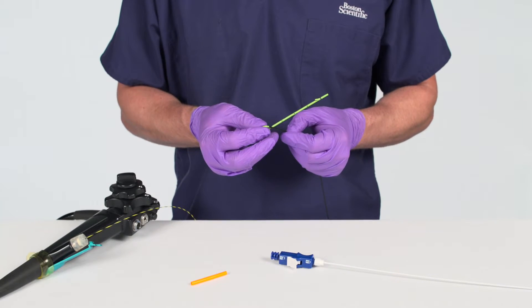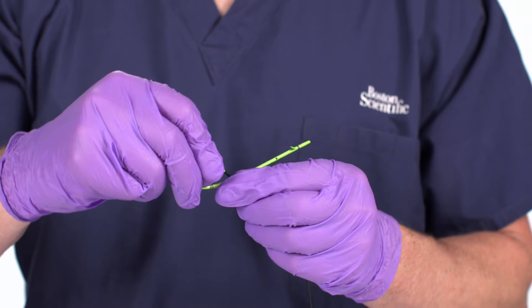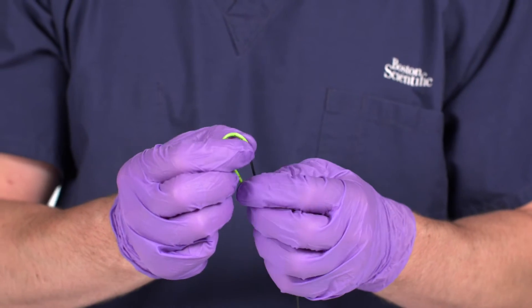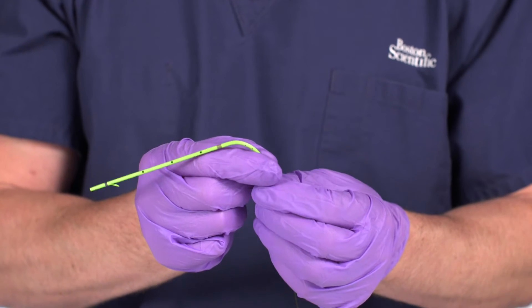Load the stent, pigtail end first, onto the guide catheter, allowing the guide catheter to pass through and straighten the pigtail. Avoid straightening the pigtail by hand.